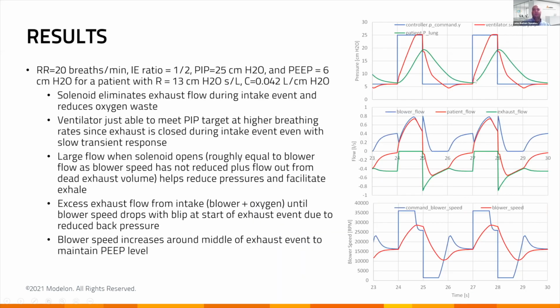So here is some simulation results. Again, pressure, flow rate, blower speed. Here is the whole list of conditions that were used for this simulation: respiratory rate, intake exhaust ratio, the patient pressure, peak inspiratory pressure, PIP, the exhale pressure, PEEP. So what did we learn from this?